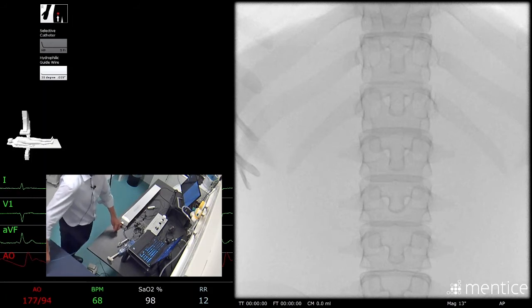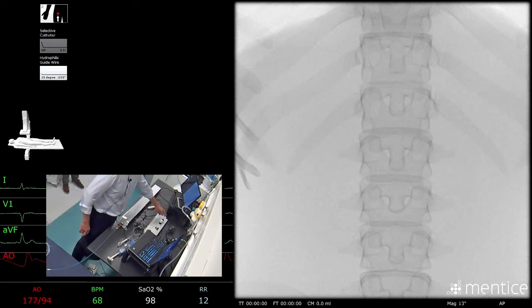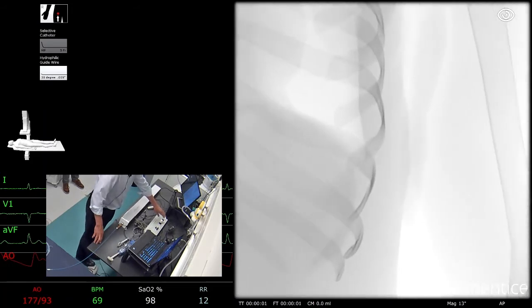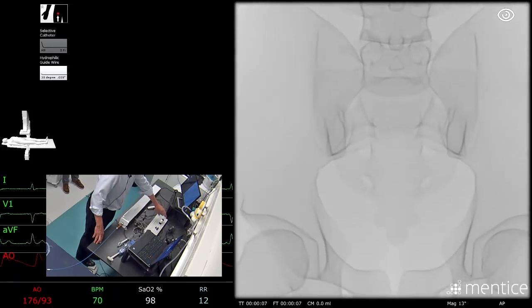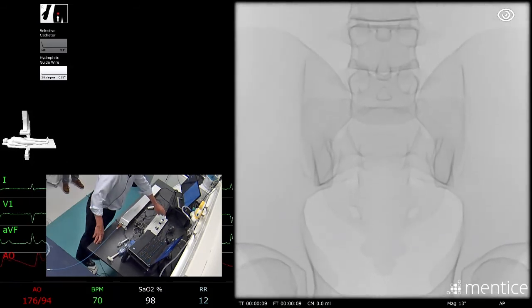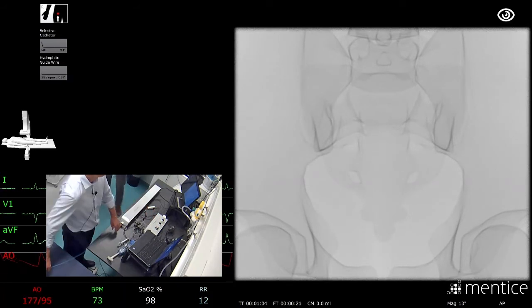So I'm going to scroll down to the level of the lesion with the assistance of fluoroscopy, and at all times trying to pay attention to limiting the amount of radiation to the patient by coning in, using the cones appropriately. So the first thing we're going to do is advance our wire through our multi-purpose angled catheter, and put the curved hydrophilic wire along this catheter up to the level of the presumed occlusion or stenosis.